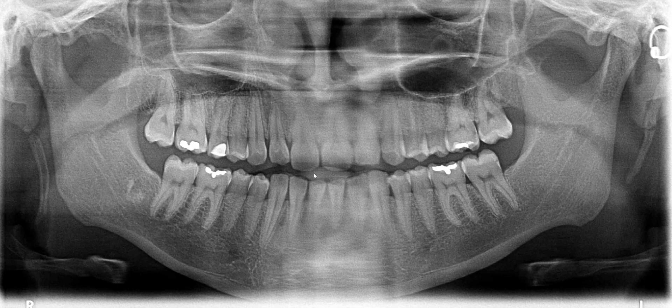I hope you can see that. It's relatively wide such that the mesiodistal distance of say tooth number nine is almost as wide as this first molar, right?